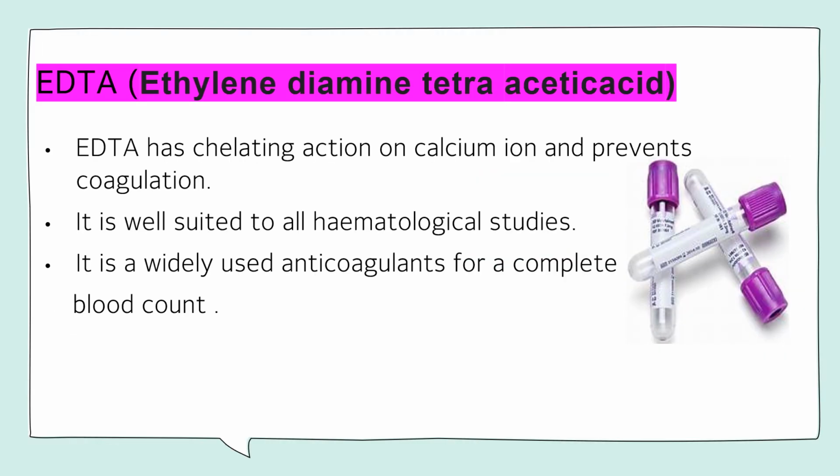EDTA, ethylenediaminetetraacetic acid. EDTA has a chelating action on calcium ion and prevents coagulation. So it is well suited to all hematological studies. It is a widely used anticoagulant for a complete blood count. All the hematological tests or complete blood count can be done using this EDTA.